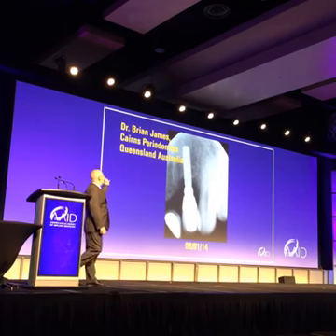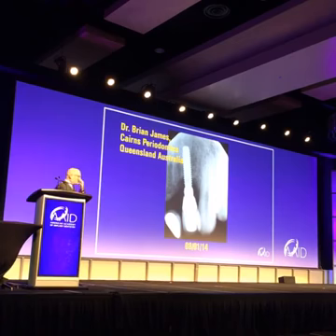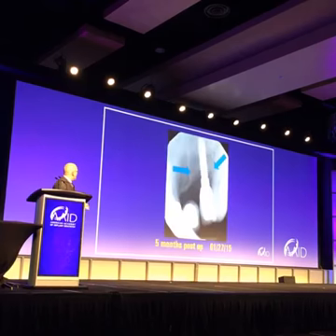So, this is Dr. Brian James. He's a friend of mine in Australia. I think he's one of the first periodontists to do this procedure. But here's one, an anterior case again. You can see the cement on the abutment. He went ahead and treated this little old lady with a LAPIP protocol.